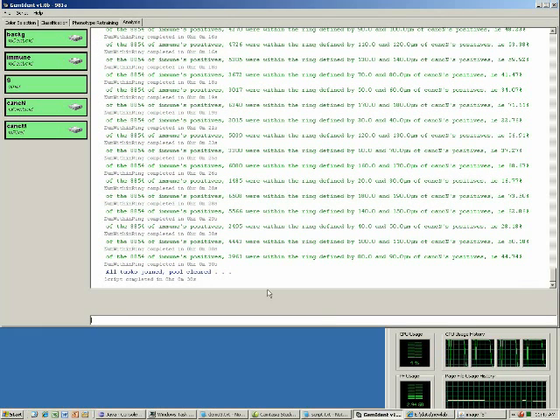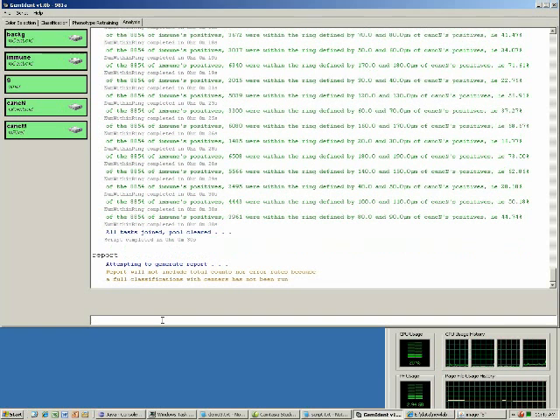Now, at the end of the analysis, it may be convenient to have output that you can email or show at a presentation. The report feature will do just that. The auto-generated PDF includes a thumbnail, as well as a transcript of the analyses and their results.